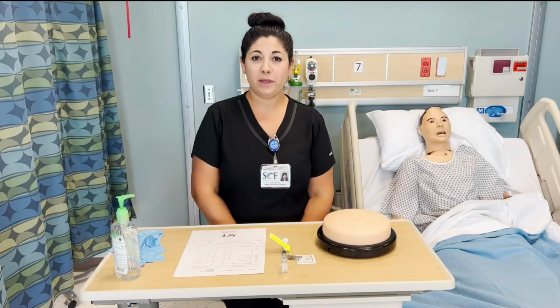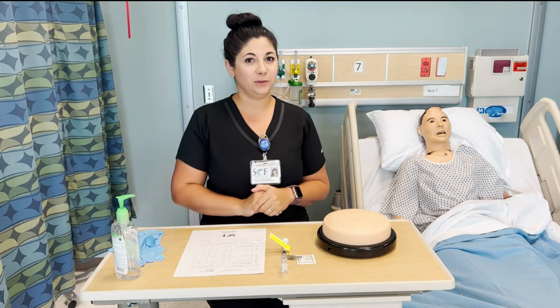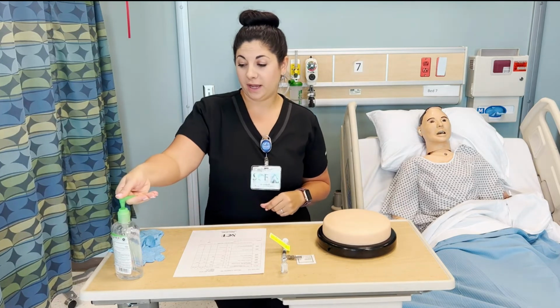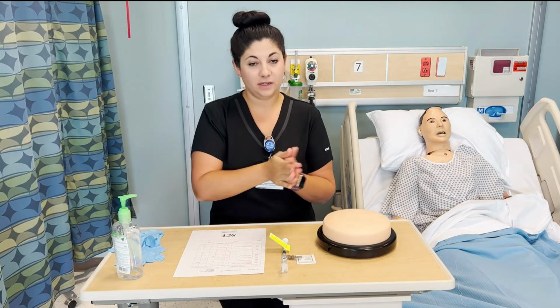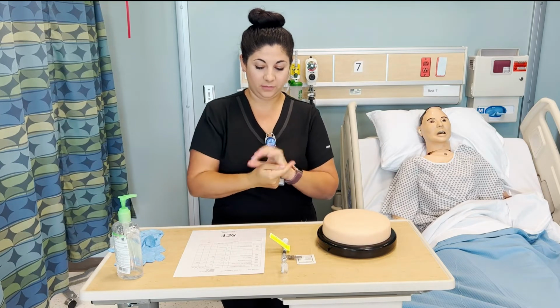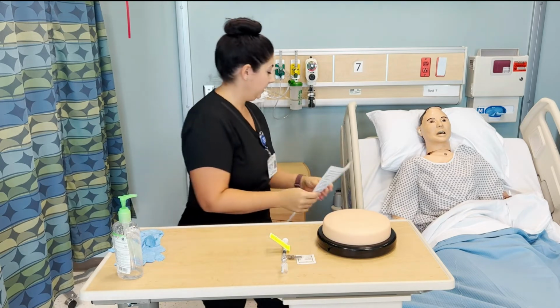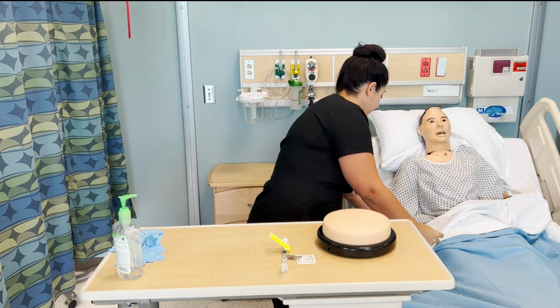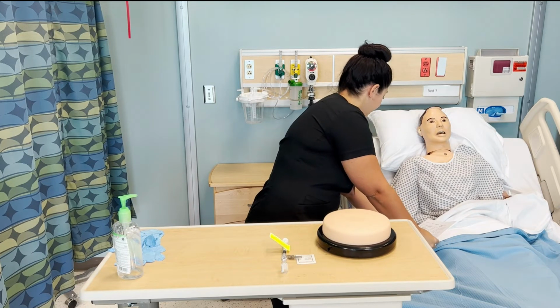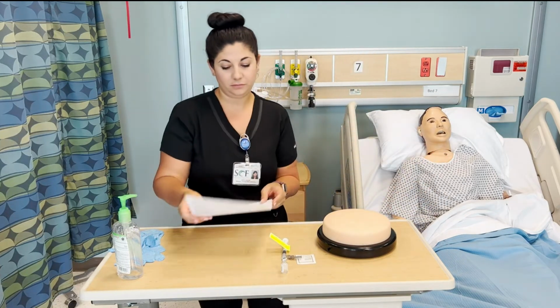I have knocked on my patient's door and entered, introduced myself, and explained what we are doing to my patient. I am going to clean my hands and do my third check. First, I will identify my patient by asking them their name and date of birth and comparing that against my MAR. And do you have any allergies? No. Okay, great.